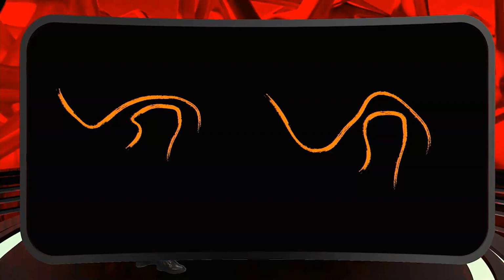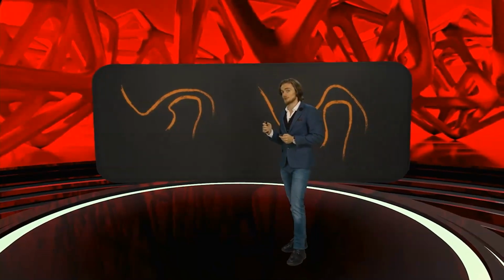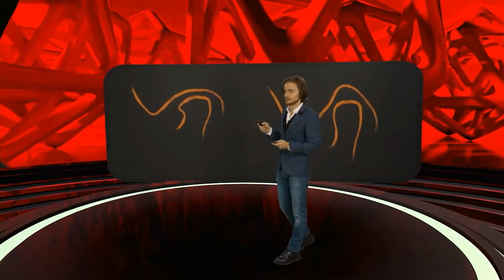But on the left, if your fossa is flat, then it will not be that easy to find that magic point. And do we really need that magic point? Or maybe we have a comfort zone and that's fine? Think about it. Think about what the study says, what the literature says, and what your patient tells you.